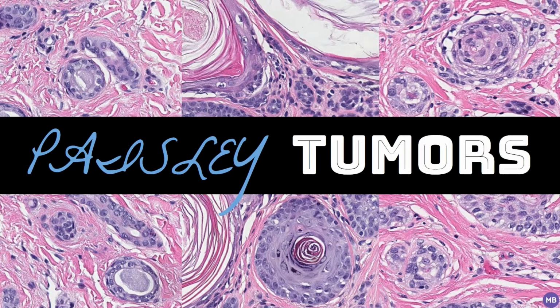Welcome to my 6th video, where I'll be focusing on adnexal tumors with a so-called Paisley or tadpole pattern. So let's jump right into things with our first case. And as usual, the whole slide imaging for this case can be found in the video description.